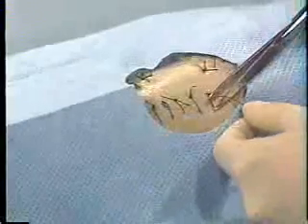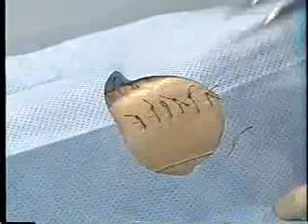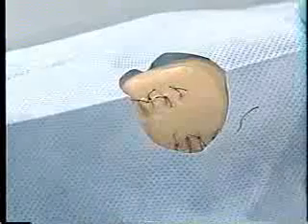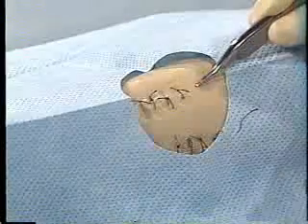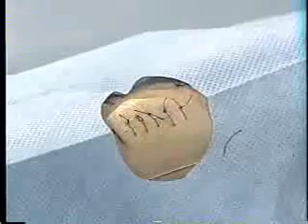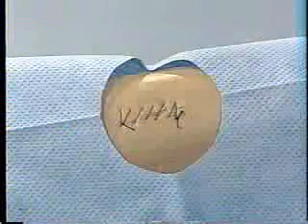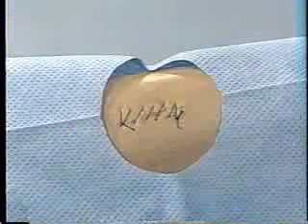Here is a wound that has been closed with the correct tension. Here is a wound that has been closed too tightly. This is a series of simple interrupted stitches. The simple interrupted technique is suitable for almost any wound. Here is a wound closed by a simple running or continuous technique.